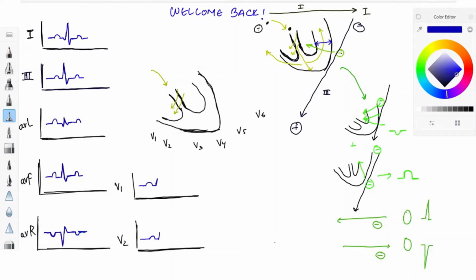Septal depolarization is recorded as small positive R waves in V1 to V2. The next step is the current going towards the apex, so it's going away from V1 and V2, so you get negative deflection, a relatively large negative deflection because the LV is predominant. And when the current dies out, it comes back to the isoelectric baseline. You have a delay after that, and then comes the repolarizing current.